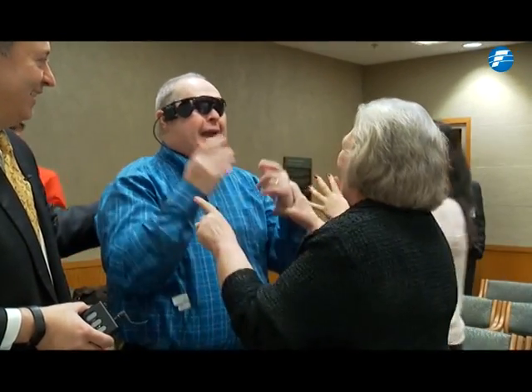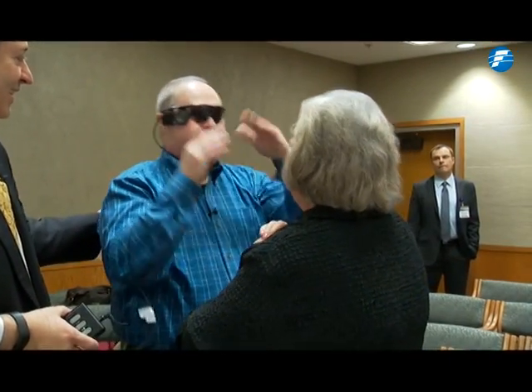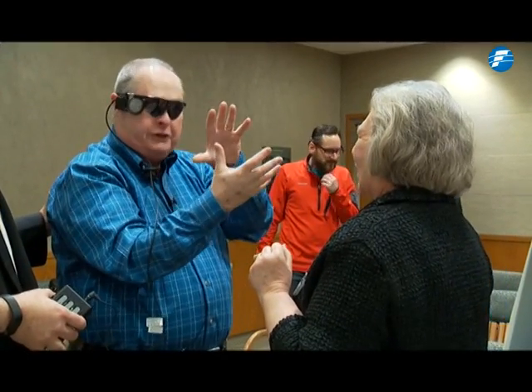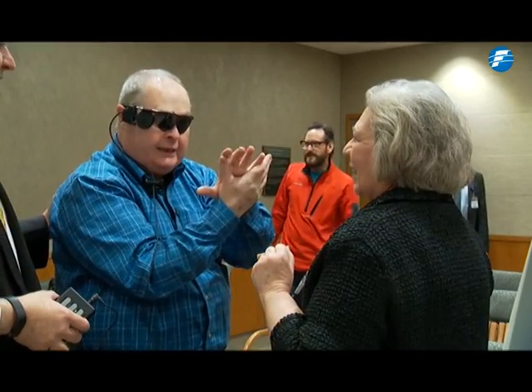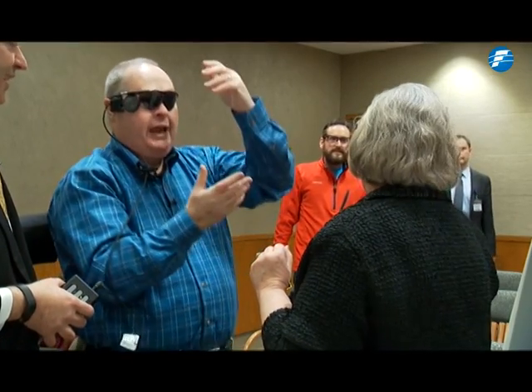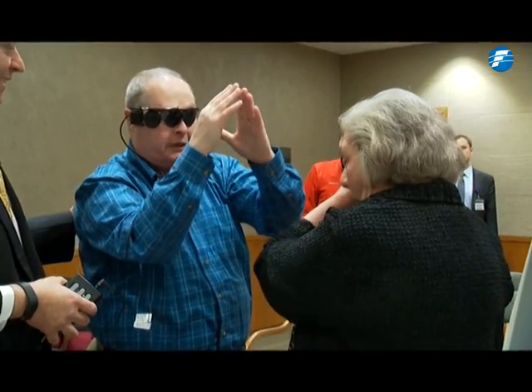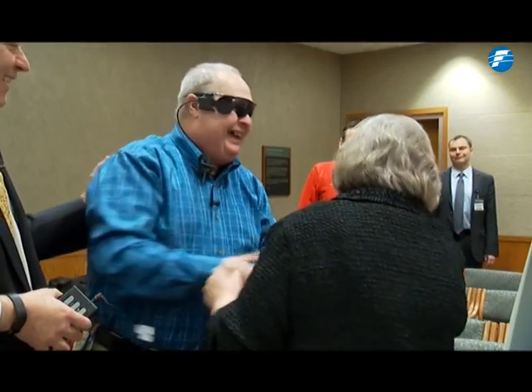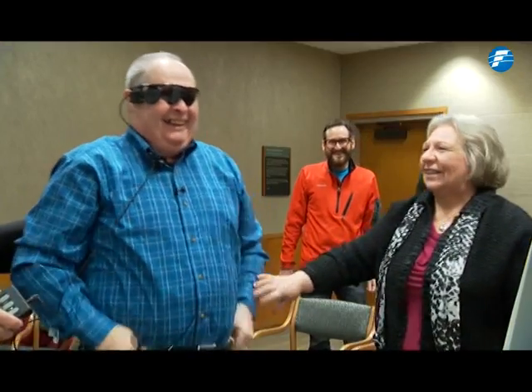It's going to take interpretation of the shape of the light that's flashing. Because it's a pulsing light, it's not like regular vision where it's constant — I've got to be able to interpret the changes in that shape. Okay, let's do it again.